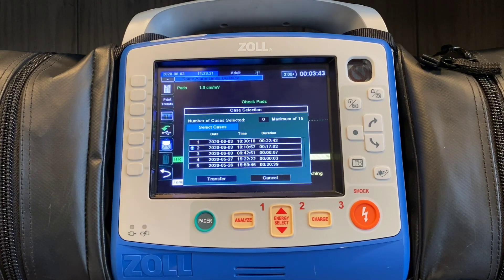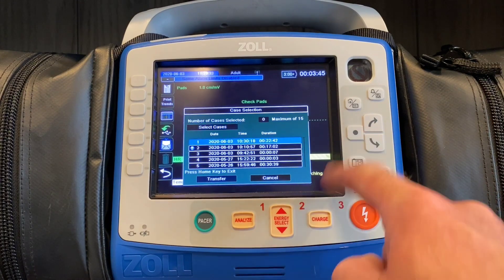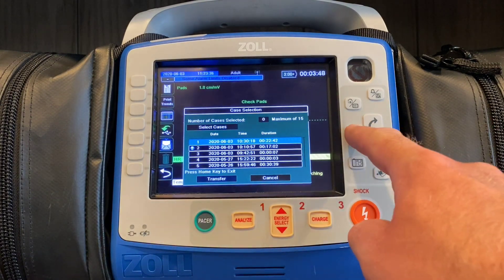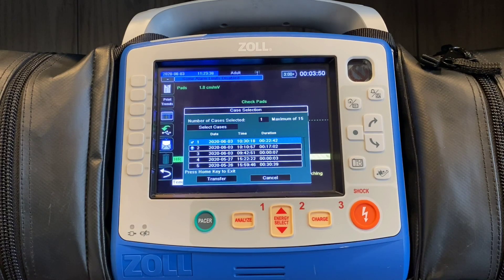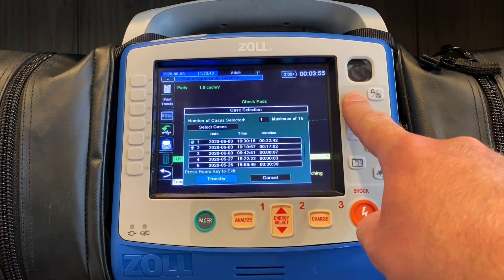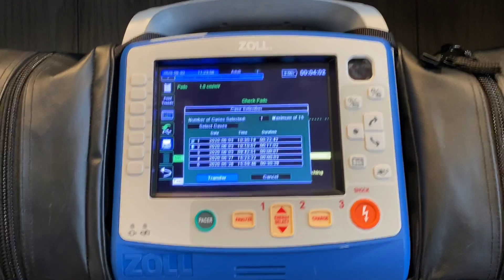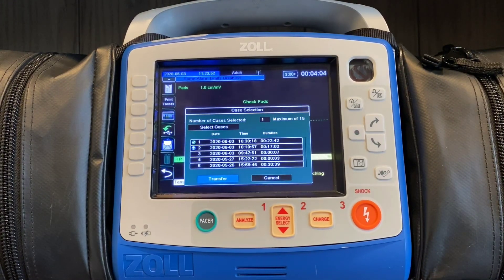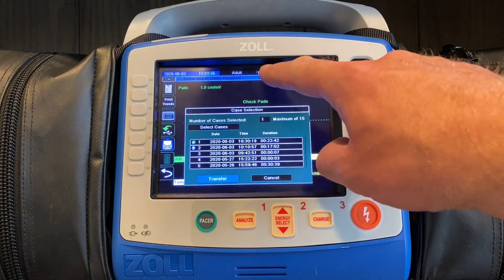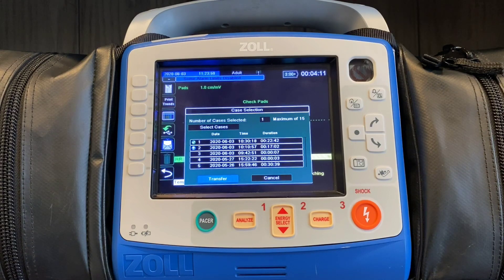The steps are hitting enter — that'll drop you down into the list of calls. Select which call that you'd like; you can select a maximum of 15 calls. You then hit the home button and transfer will be lit up. The next step is going to be to transfer this data. This is contingent on you having some sort of connectivity to the internet, so whether that be Wi-Fi or a cellular connection, you just want to make sure that you have some sort of available internet connectivity.